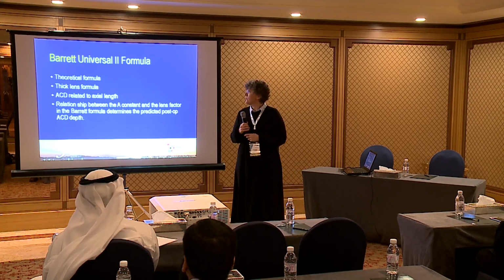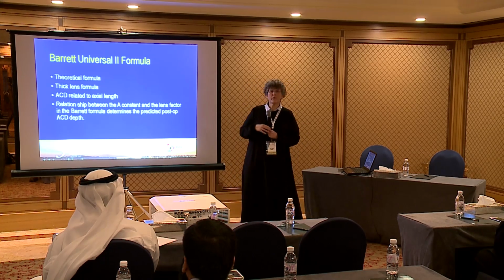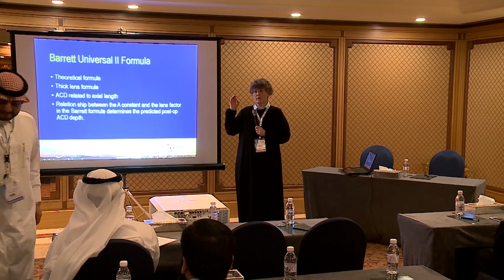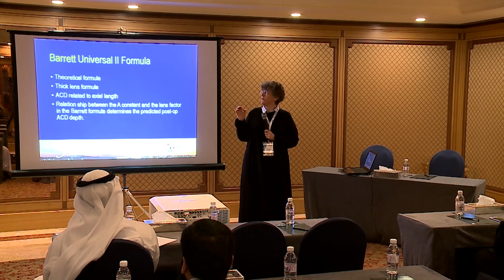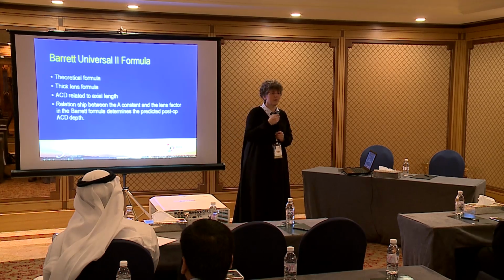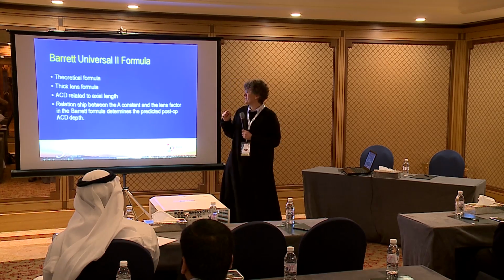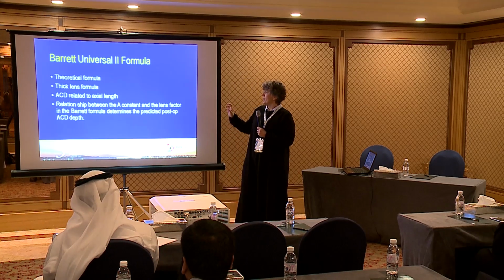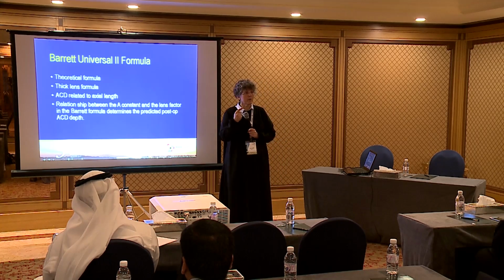Then Barrett from Australia, he wrote a theoretical formula, and he went from a totally different point of view. All the formulas that I mentioned until now are thin lens formulas. And he said, I'm going to make a thick lens formula. He's a very smart man. I'm not that good in physics, so I can't really explain this. But again, the ACD is related to your result. And he said that there's a relationship between the A constant of the lens and the lens factor. And actually what he's trying to predict is also the post-operative ACD.